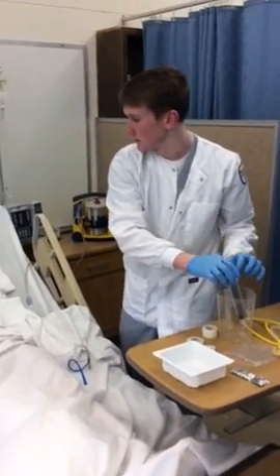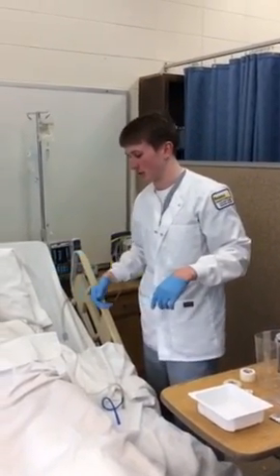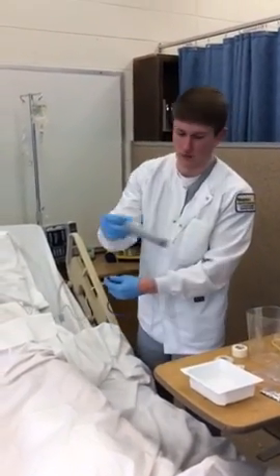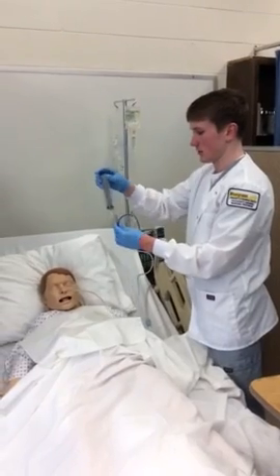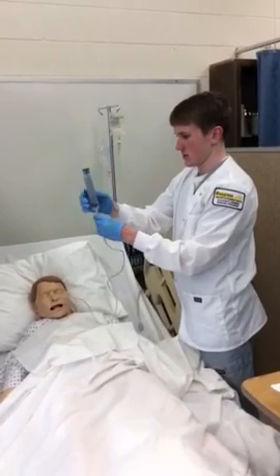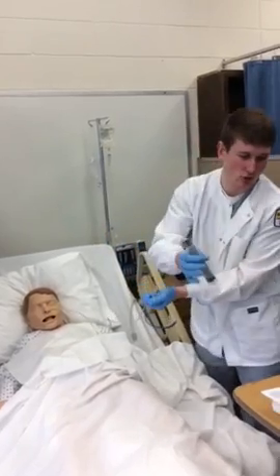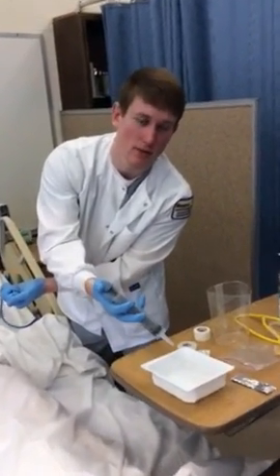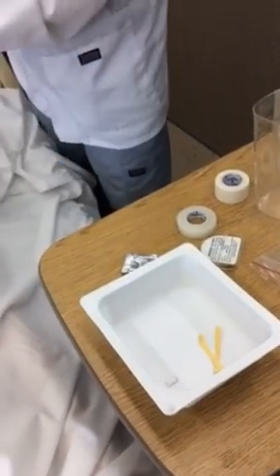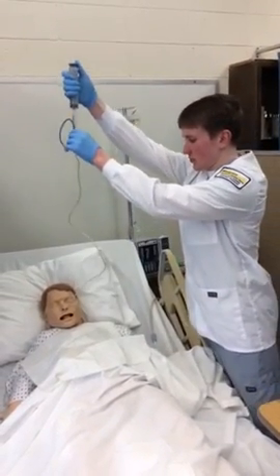Okay. So, it says look for any respiratory complications such as coughing, which would indicate it's in the lungs and not the stomach. There's none of that going on, so now I can aspirate the stomach contents just a little bit. Kink that and drop that on one of these. Drop the stomach secretions on a little bit of the pH pad right there. And then if I have any leftover secretions, unkink the tube, and then return that to the patient.